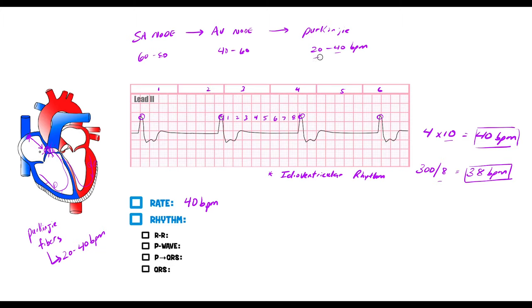40 beats per minute falls right in the range of the Purkinje system or idioventricular rhythm. Now let's determine the rhythm. The R-to-R interval: counting one through eight boxes between each complex — they're all about eight boxes, consistent across the strip. So the rhythm is regular.